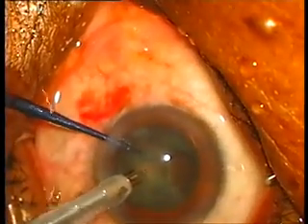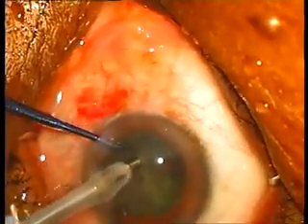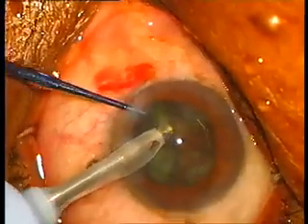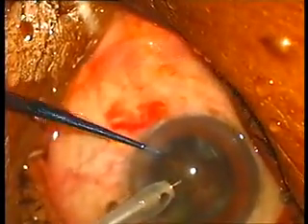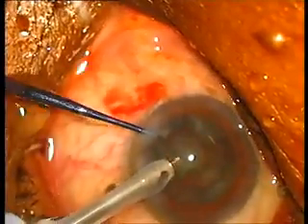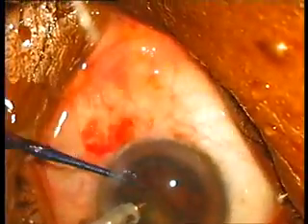Since these patients live very far off, they will not come for follow-up. So I prefer this kind of surgical intervention in patients suffering from glaucoma as well as cataract. This microtract filtration has really revolutionized the care of patients with glaucoma.